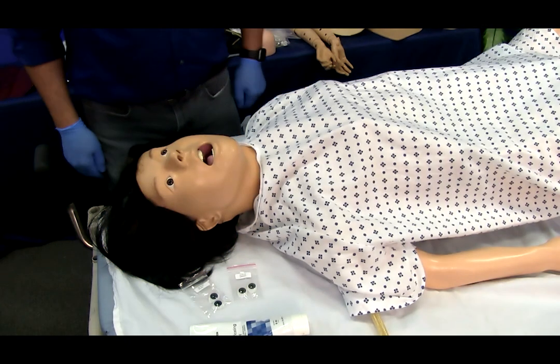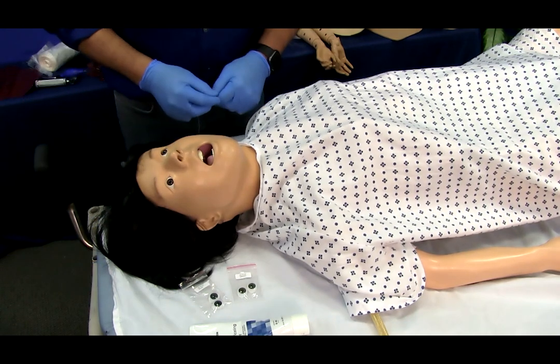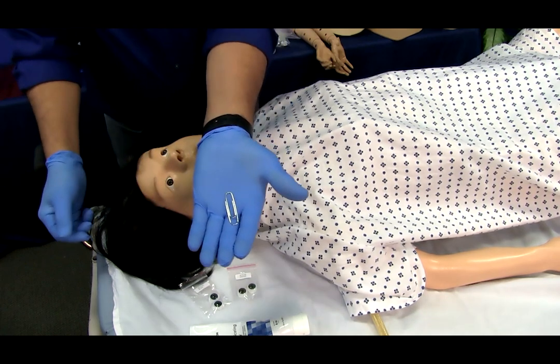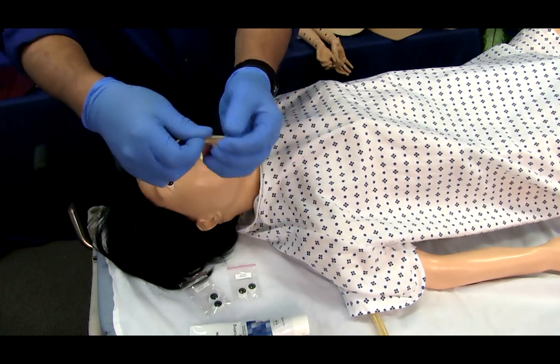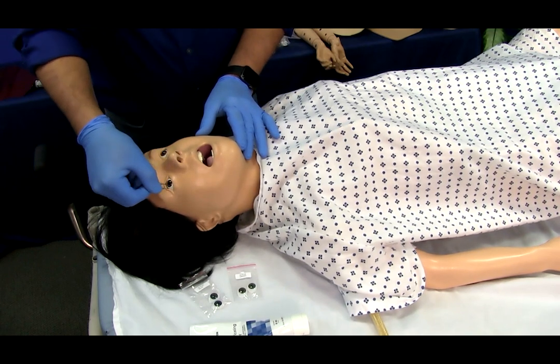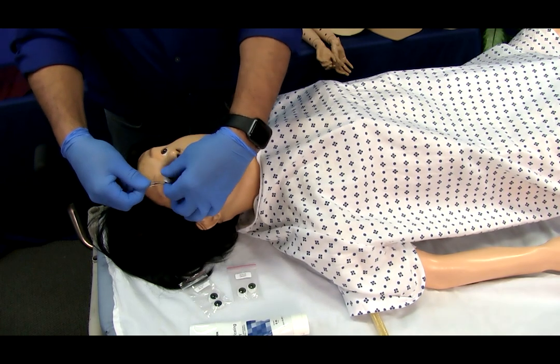To change the eye color on Lucy, pry the eye out from the upper lid using a paper clip or similar object, such as a small spoon provided with the manikin in the advanced Lucy. Never use a sharp or pointed tool. Pull the eye free from the socket.